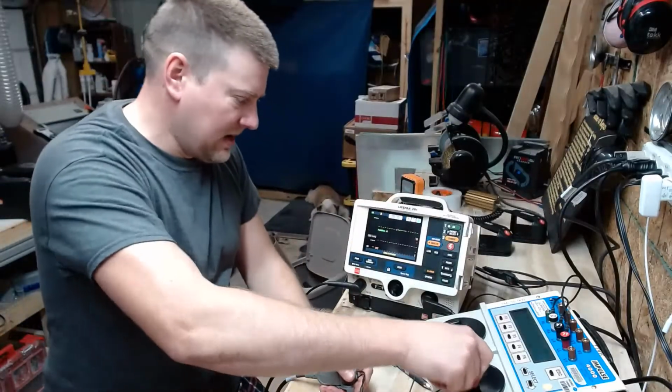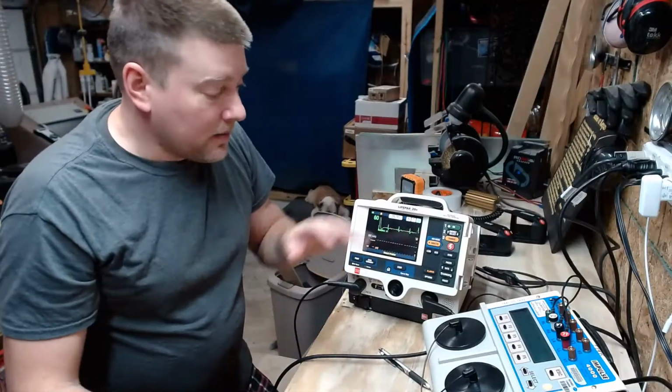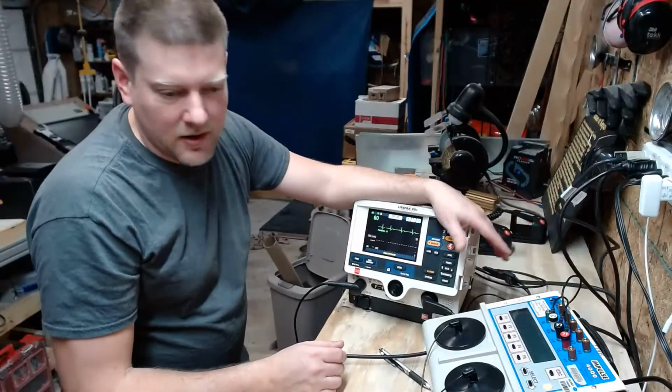I can tell I got some bad cables here or something. But that's one of the most important things that we test on this. And then after that is going to be your other standard tests.